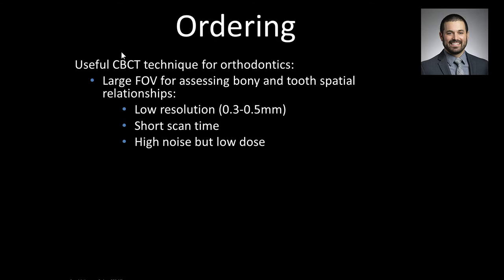The detail needs for this setup are not like in endodontics. You just need to see where things roughly are in relation to other structures.